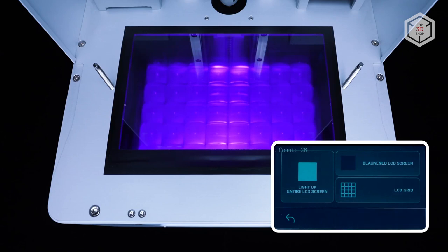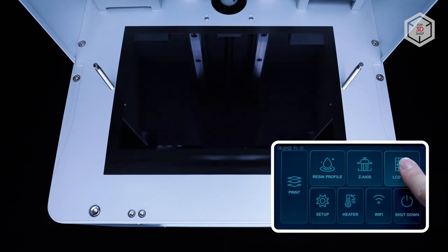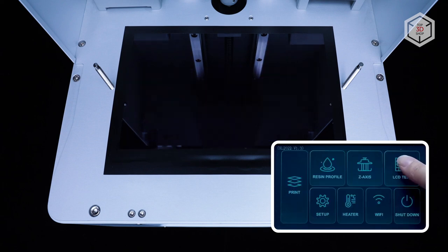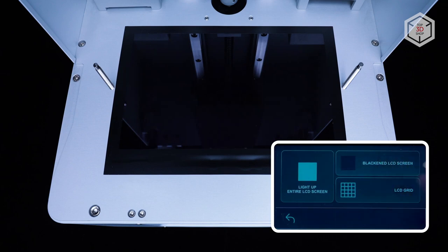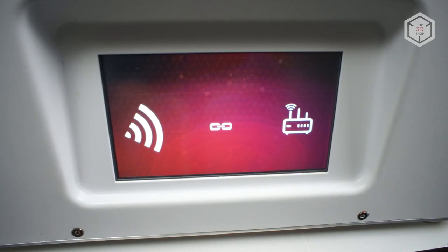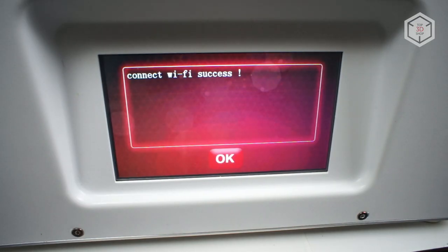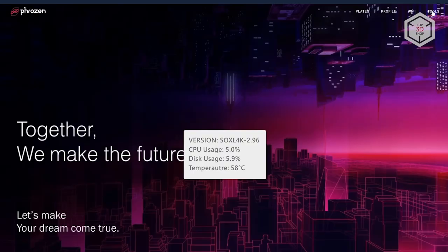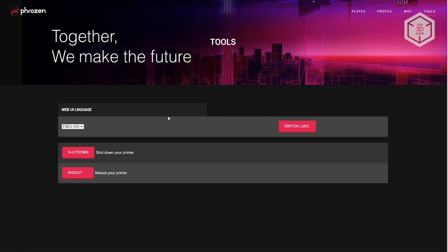In addition to a renewed interface, there are also several innovations to the firmware, such as the option to change the power of the LED projector, adjust the temperature inside the printer, and resume printing after a power outage. When the machine is connected to a local network via cable or Wi-Fi, you will see its IP address at the top of the screen. By accessing this address through a web browser, you will be taken to the printer's web interface. We will cover this in more detail.